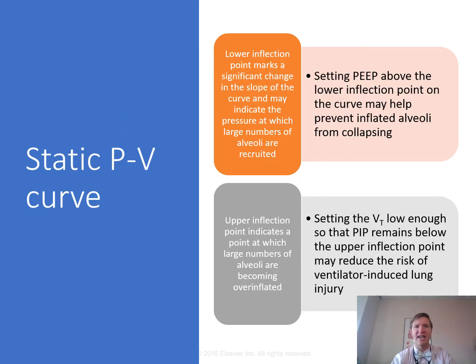All right, static curves. When we're looking at this, the pressure-volume relationship for dynamic and static compliance can be plotted by ventilating the lung at different volumes and recording the PIP and plateau. There was a study by Bone and colleagues that first described a bedside measurement technique for drawing static pressure-volume curves well over 40 years ago. And then they would plot the PV curves. And this is something that's a valuable tool.